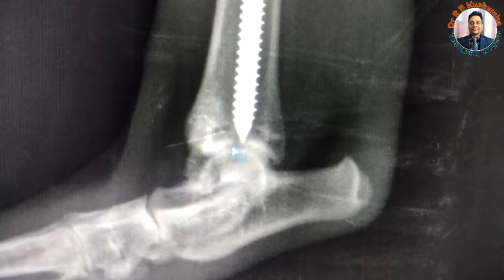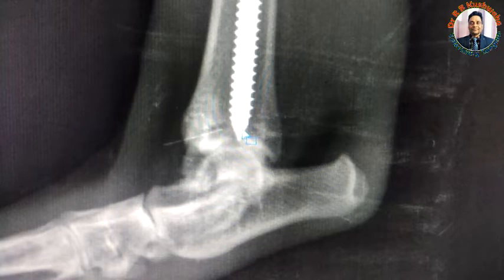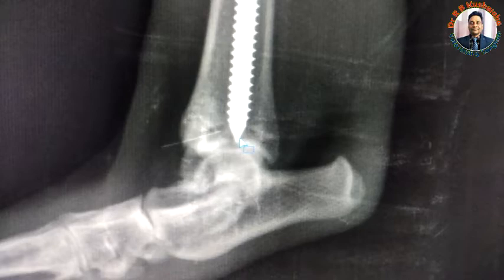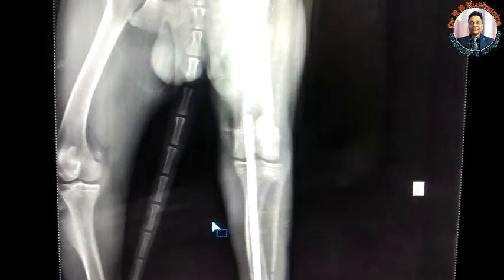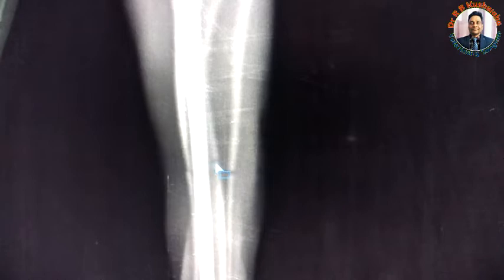It would be better if I rotate the pin back a few rotations so that it moves approximately 2 to 3 mm. It is just a precautionary measure; otherwise even this position is also good. In the orthogonal craniocaudal view, you can see the pin is in the medullary cavity — confirming the pin is inside the medullary cavity. You can appreciate how beautifully the reduction is achieved and the pin is seated nicely in the distal segment.